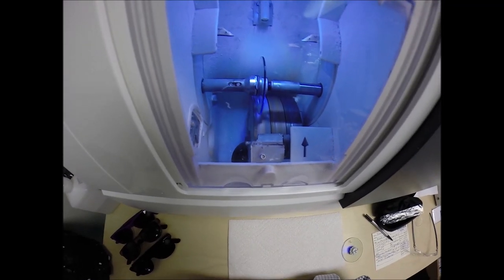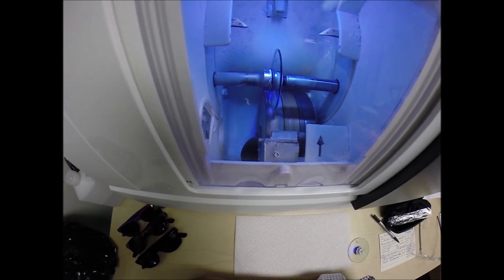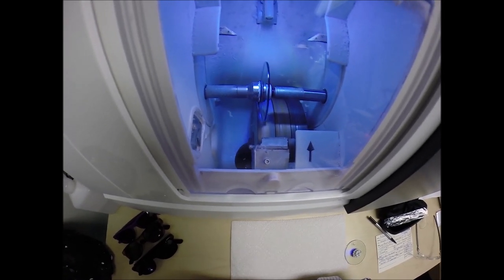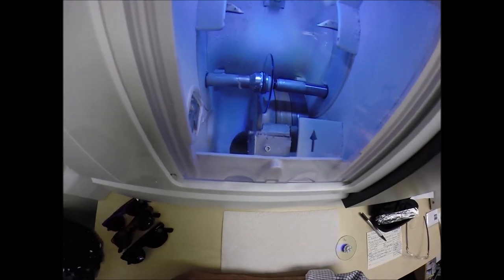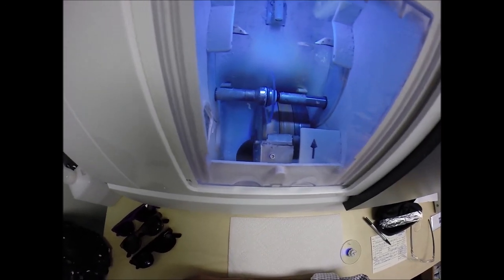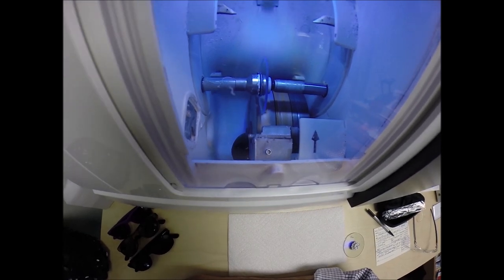Now, I do have a special on edge thickness. But that ended yesterday, so nobody gets free edge thickness without paying for it. If you want super thick lenses, that costs extra. You didn't pay for super thick lenses, so you're not getting them. You hear me, Robert? So, the lens has touched down on the cutting wheel.